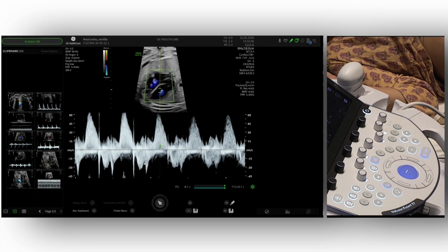And then the atria will contract, so here we will have the inflow because of the atrial contraction. And then in the positive part, the aorta is going positive, that will be the aortic blood flow. So at the same time, we are having the mechanical reflection of the atrial contraction and the ventricular contraction.